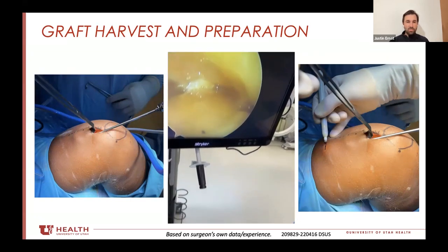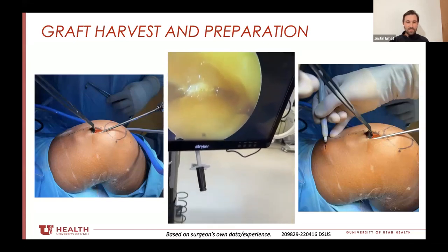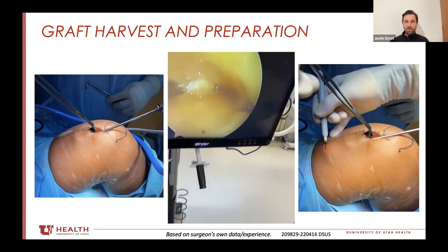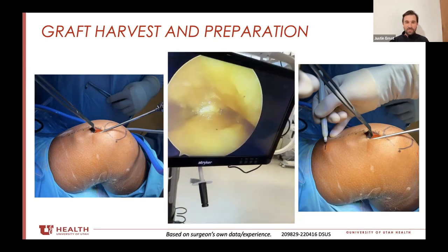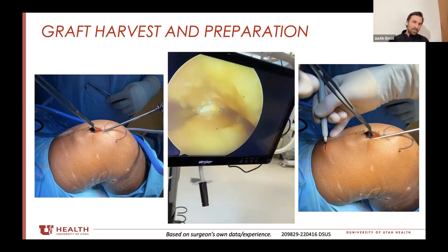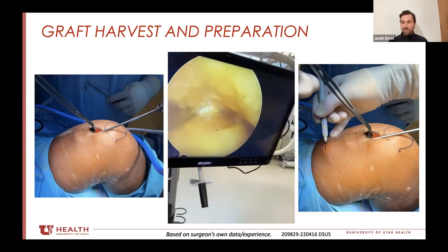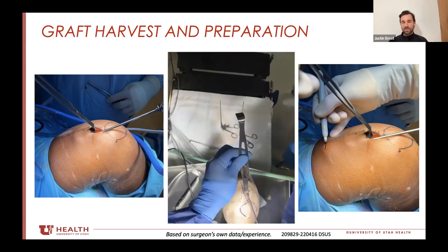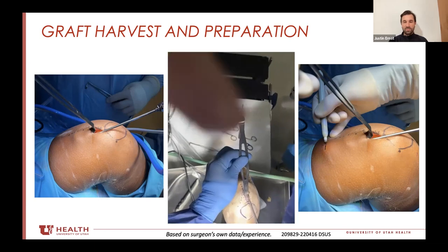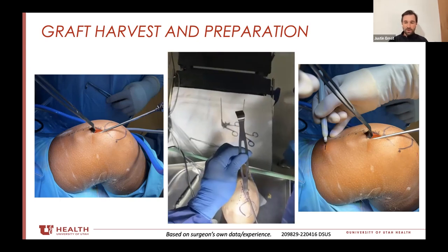Once elevated off, I stick the scope camera up the quad tendon and visualize the trajectory as well as where the muscle lies and where muscle meets tendon. As you can see, I mark where the light transilluminates the skin — that gives me a good idea of the extent of the quad tendon so I can use a small, cosmetically friendly incision. I can also pinch the camera at the level of the incision and pull it out to get an idea of how long the graft is going to be. You need at least 65 millimeters of graft to make this work.